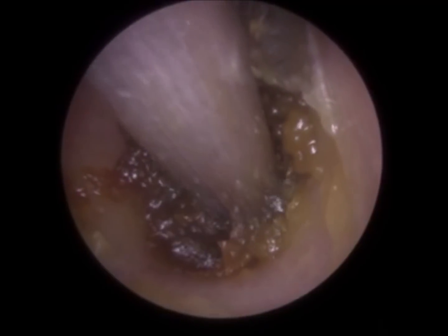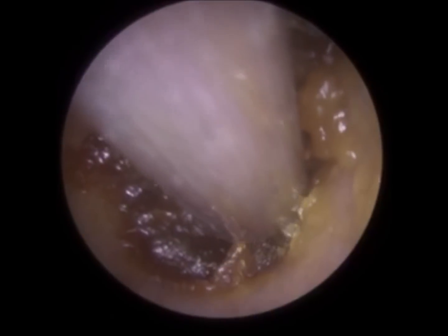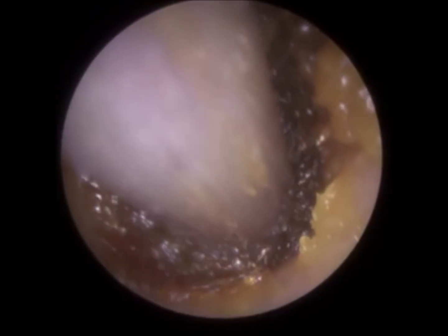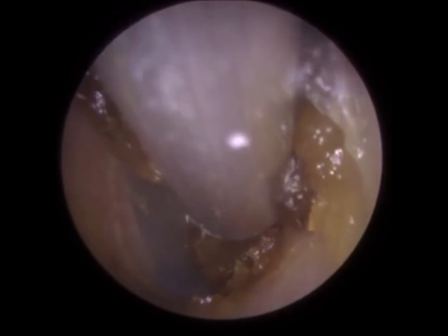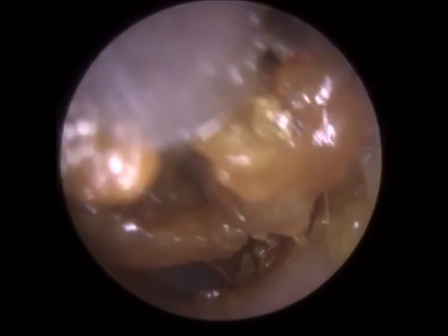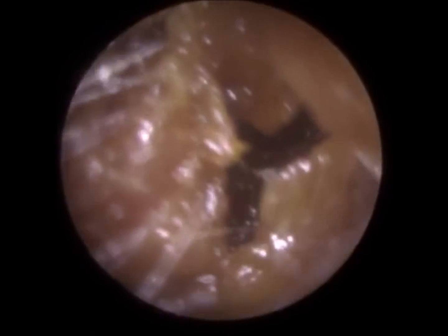I'm not sure, it's the first time I've watched it back, so I'm not sure if it shows when you watch the video itself, but I'm always just ready to quickly pull out the suction probe if the patient makes any sudden head movements. So you can see a bit of the tympanic membrane posteriorly. Patient had been using drops, so that definitely helped.